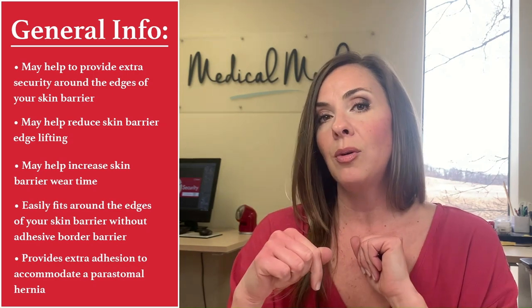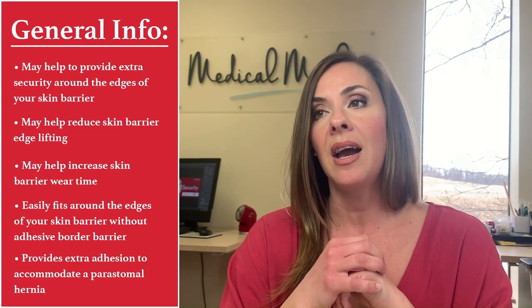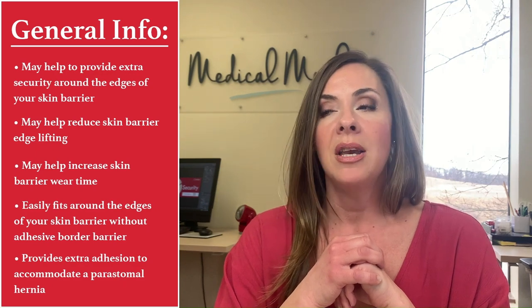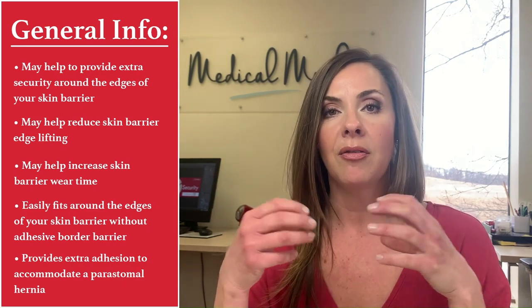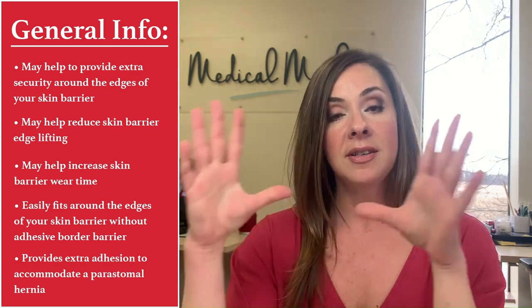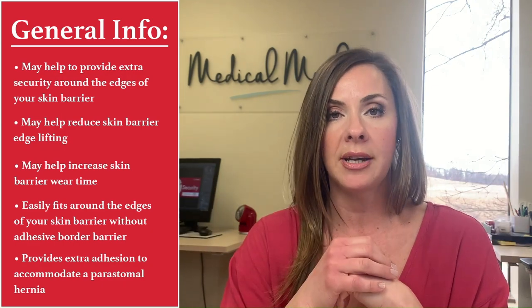The other thing we would recommend this for is any kind of hernia or skin grooves, any pulling or pinching maybe from the surgery initially where you can't get good adhesion on your wafer. This is going to cover that area and make sure it's protected.